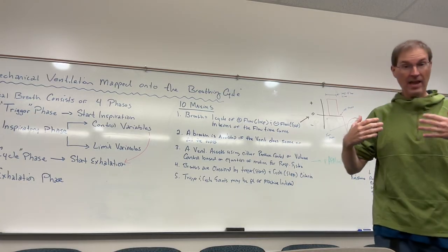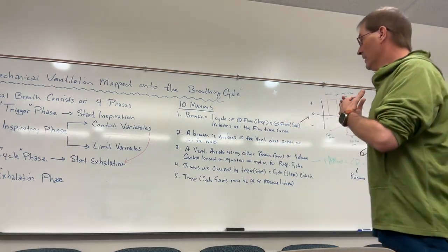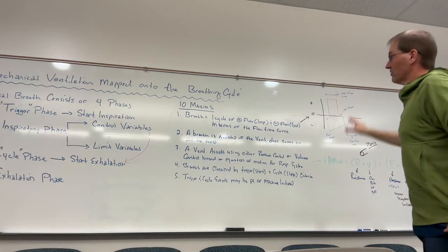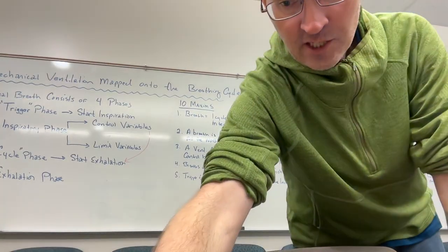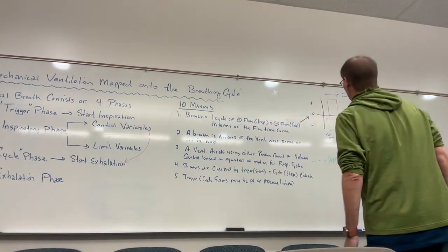And this is a graphical representation of a breath that is used in this context to define a breath. This is actually a graphic that some ventilators allow you to sense, detect, and look at sometimes in real time. So we look at a breath.